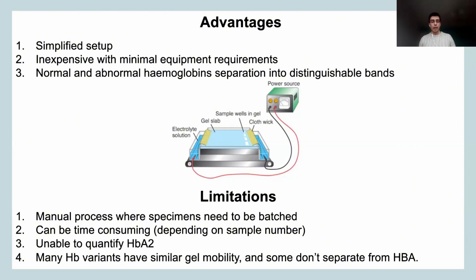It's quite manual, depending on the amount of samples you need to process, and they need to be batched together, so you will be able to process them in a timely manner. Might be complicated. And being a manual process, it is not difficult to make manual processing errors as well, mispipetting in the wrong well. So that is a disadvantage of relying on such a technique as well.